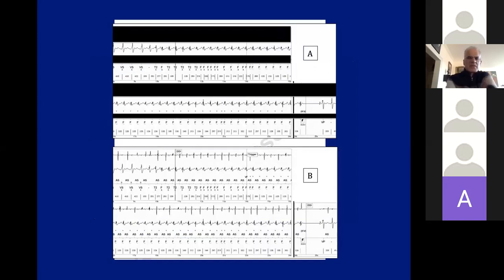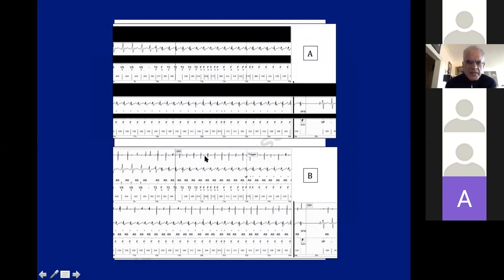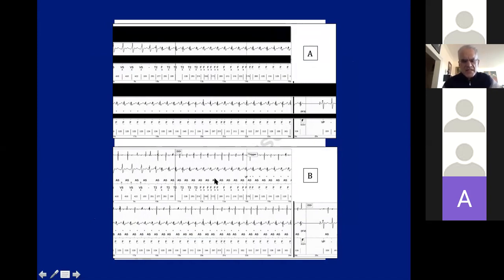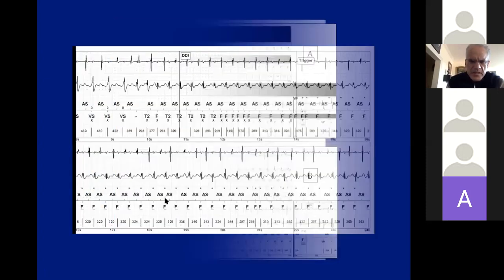Here's another, more complex example. The atrial channel is covered on top. You can see that morphology changes, and despite that, the device thinks this is VF. But when you look at the atrial channel, there is one-to-one AV association — this was actually SVT. It starts with a PAC, not a PVC. Let me enlarge it so it's easier to see. When it starts, it starts with a PAC.